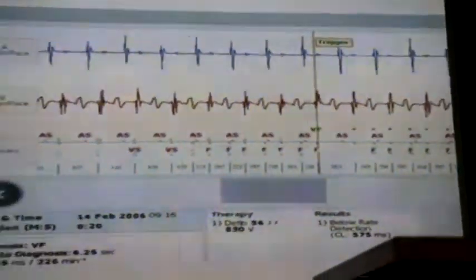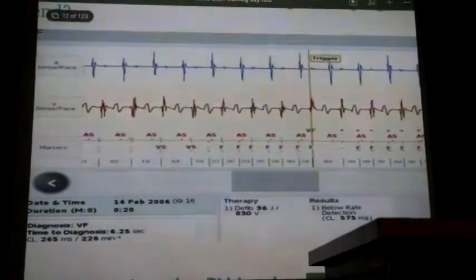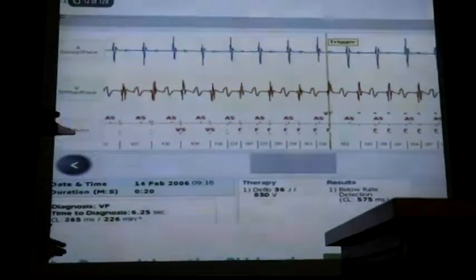So we got some T wave oversensing. And what's the R wave here? Measurement of the R wave. Yeah, R wave is 3. So the device is going at 50% of 3, it's 1.5, and then declining down, okay? And this is almost always what you see. Almost always, if you get T-wave oversensing, it's this, okay?